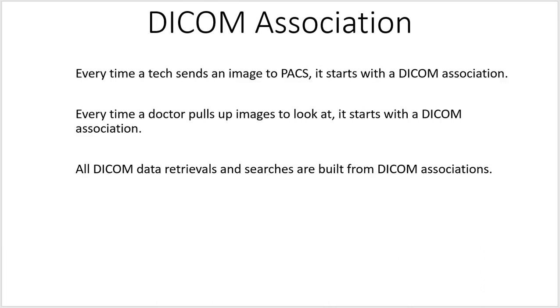Today we're going to talk about DICOM association. Every time a tech sends an image to PACS, it starts with a DICOM association. Every time a doctor pulls up images to look at, it starts with a DICOM association. All DICOM data retrievals and searches are built from DICOM associations.